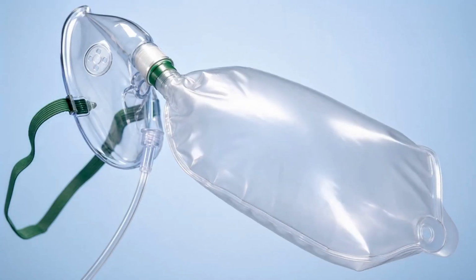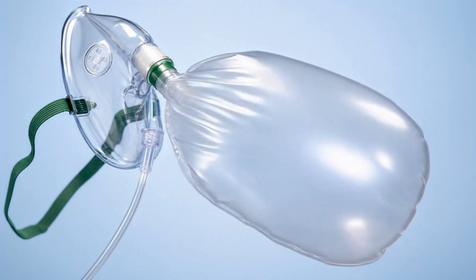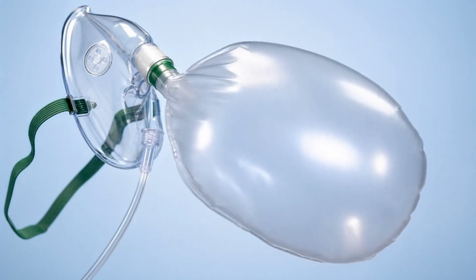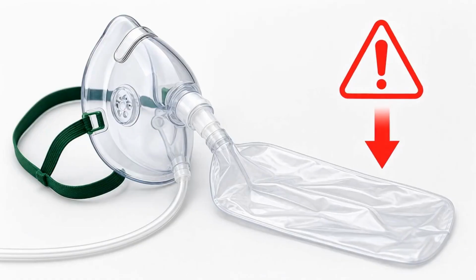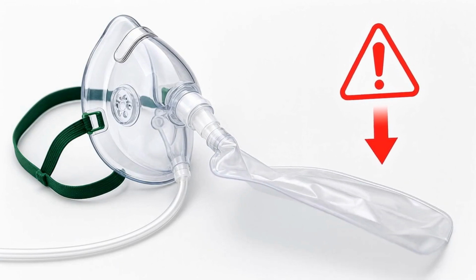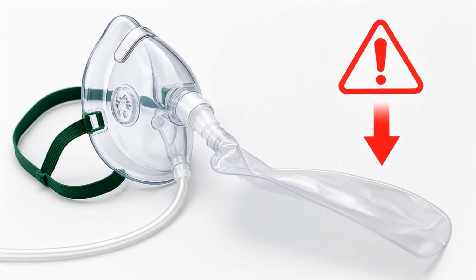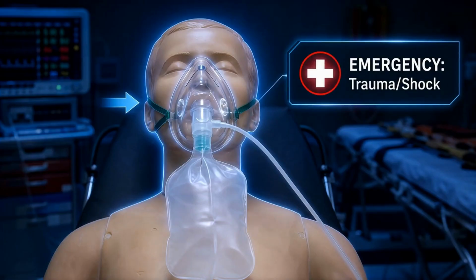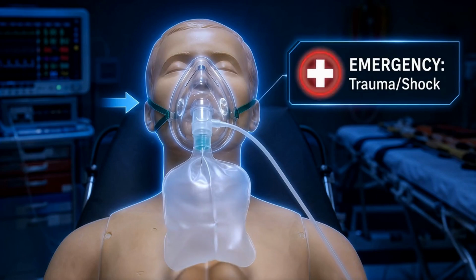The mask features a reservoir bag that must remain partially inflated at all times to ensure the patient receives the intended flow. If you notice the bag collapsing completely during inhalation, the oxygen flow is insufficient and must be adjusted immediately for safety. Non-rebreather masks are reserved for emergencies.